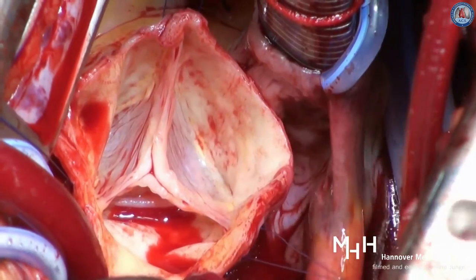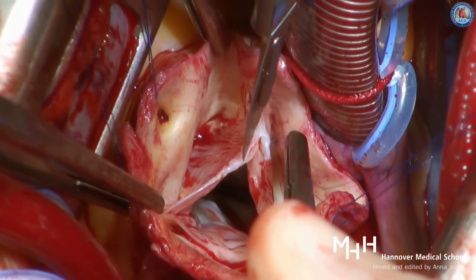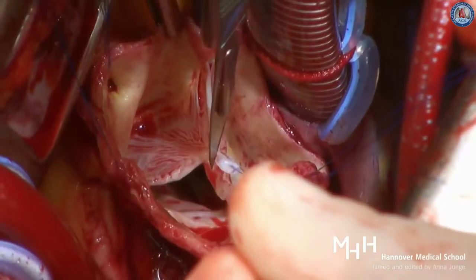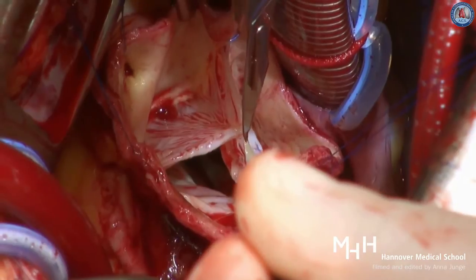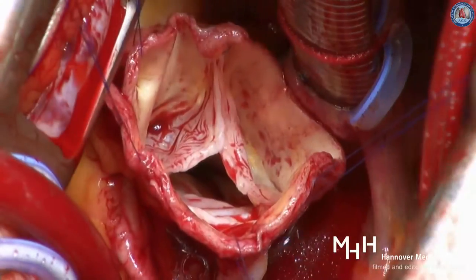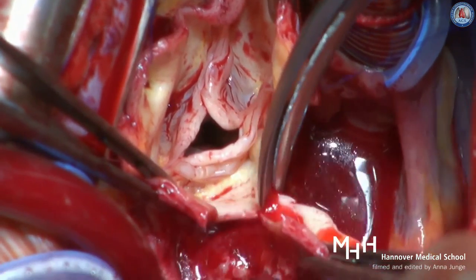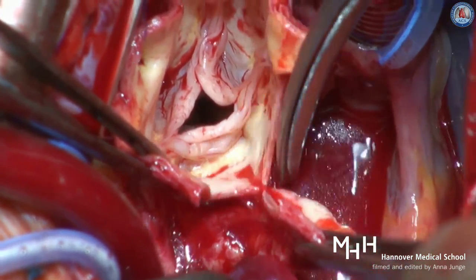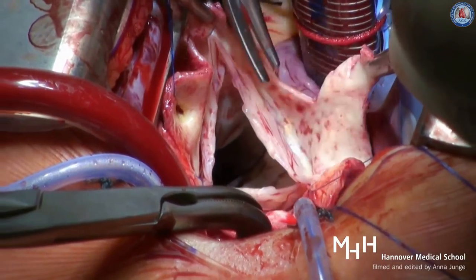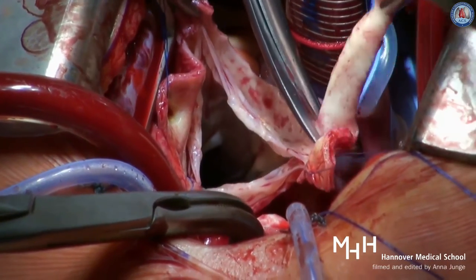The aortic sinuses are resected to leave a rim of approximately 5 mm of the aortic wall, and the coronary ostia are excised as buttons. If necessary, leaflet repair is performed to optimize cusp coaptation. The diameter of the aortic annulus is determined with Hegar's dilator, and the diameter of the prosthesis is then calculated. The diameter of the Hegar's dilator plus 2 sizes determines the diameter of the graft.